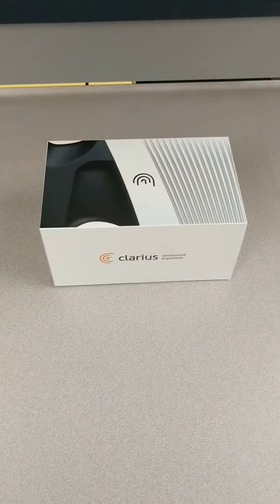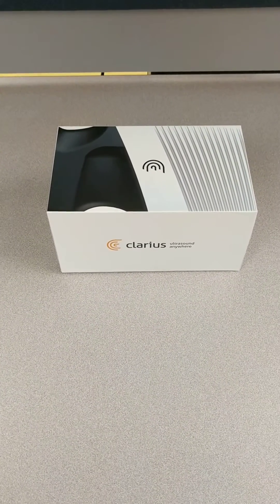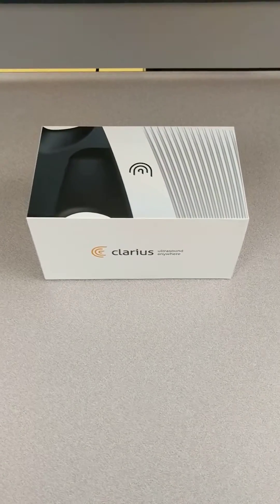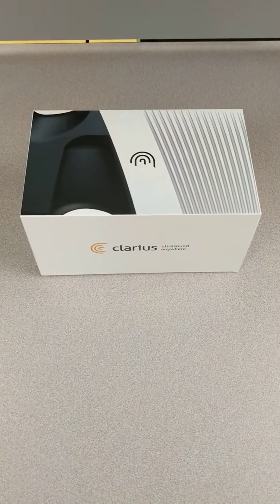Alright, so I'm going to unbox the new Clarius ultrasound machine. The cool thing about having this is that this is one of the first Clarius machines to be shipped out. It's an ultrasound machine in a box — not a crate that needs to be carried in by five guys, but something that can almost fit in your back pocket.